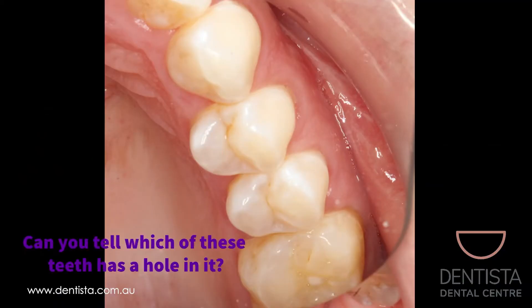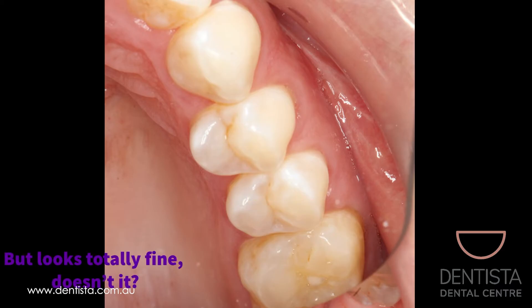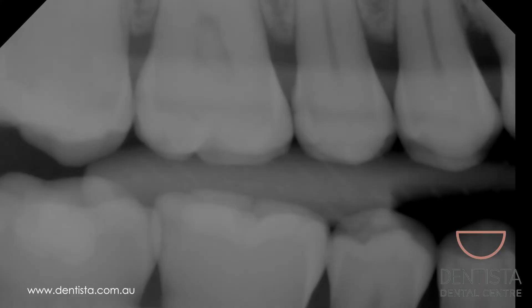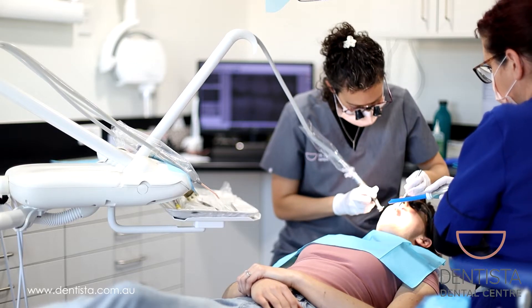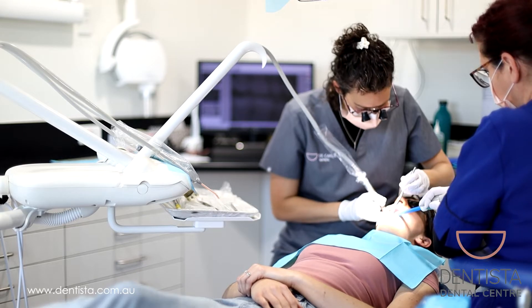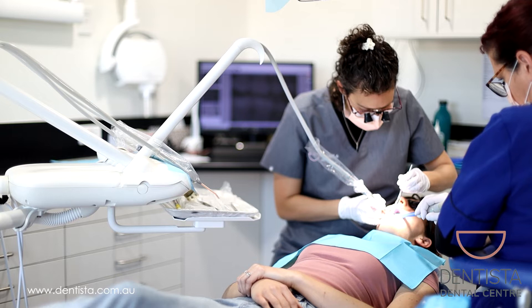One of these teeth needs filling but it's hard to tell which one it is, isn't it? It's that one. The reason we know this tooth needs a filling is because we can see it on the x-ray. This is why x-rays are so valuable. Fixing a cavity when it's nice and small is better for your tooth and less expensive to fix than a big hole.